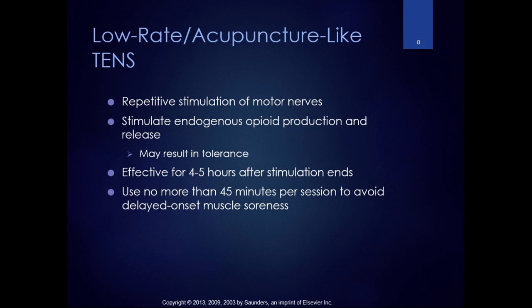So actually I've had good success in the clinic when I have someone that comes in that has a headache. We're doing different things. If they have a headache that day when they're coming in, at the end of the session, do a low rate. It could be TENS, or there's a low rate setting on IFC, interferential current. And I found it very effective for headache management.